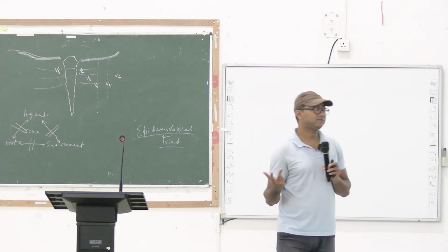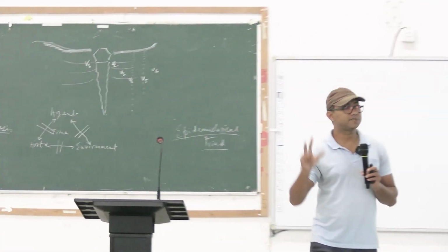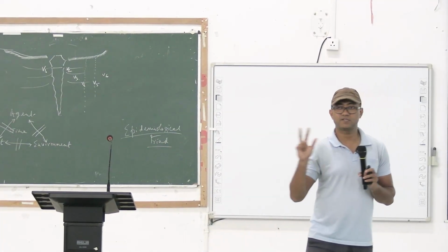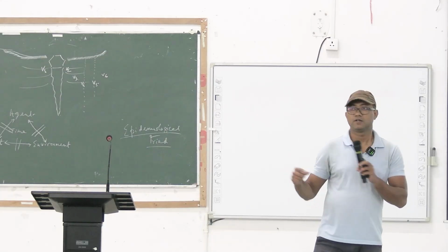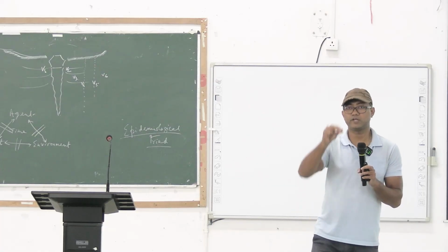Anyone? A lead is always a thing which measures potential difference between 2 points. In case of lead 1, it measures potential difference between right arm and left arm. What about lead V1? It is also a lead, but we are putting only one clip.